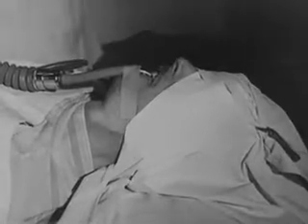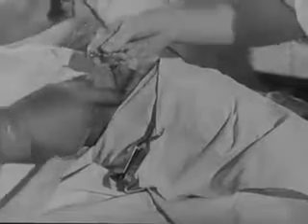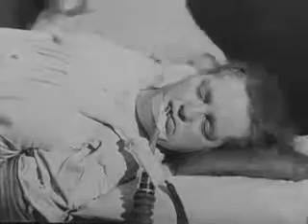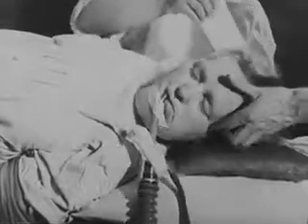In operations in the region of the head and neck, the tube can be passed through the mouth or through the nose according to the site of the operation. Obviously, when no contraindication exists, the oral route is indicated for an operation on the nose, and the nasal route is used when the site of the operation is the mouth. In other operations, it is preferable to choose the oral route, as this ensures the use of a tube of optimum caliber.